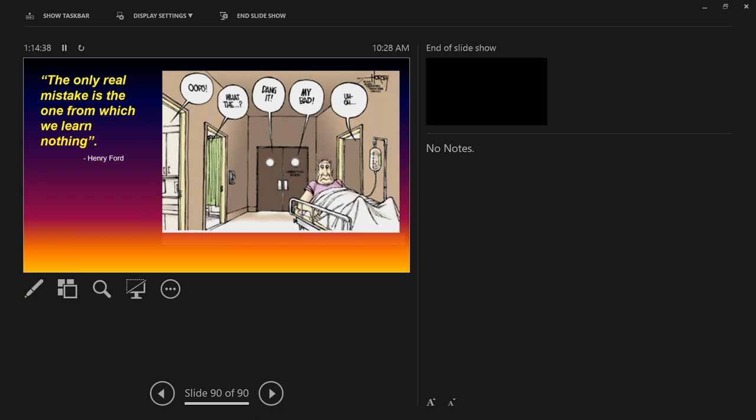Yeah, you don't know. Because with these burns, that type of burn in particular, it's outside the surgeon's field of view. They don't think they're doing it. They can't even see it, since they're looking down a little narrow tube. So yeah, if you can give the right metrics, come back. Is that what you're saying, basically? Yeah. The only thing we can potentially do is be proactive about getting your CS people to be aware of these things and giving them the right testing equipment, which can be a stretch. They're not into testing stuff like that, doing it correctly.